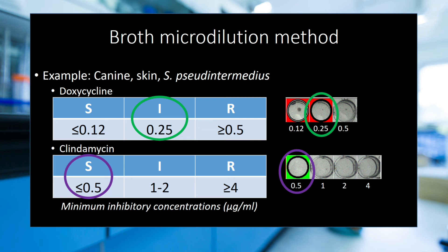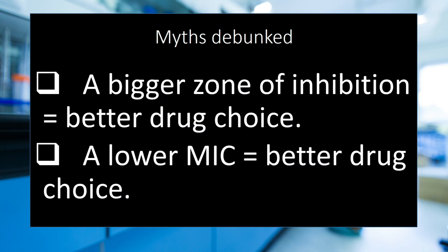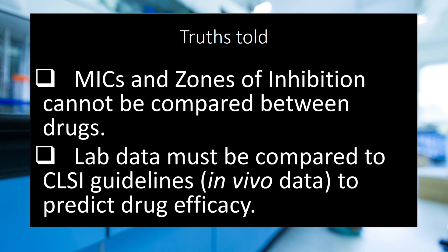It is common for people to lean towards selecting the drug with the lower MIC. However, in this example, you can appreciate that the drug with the lower MIC was not the best choice. Let's debunk some common myths about AST interpretation. A bigger zone of inhibition equals a better drug choice — nope, not true. A lower MIC equals the better drug choice — again, not true. MICs and zones of inhibition cannot be compared between drugs. Laboratory data must be compared to CLSI guidelines, which are based on in vivo data, to predict drug efficacy.